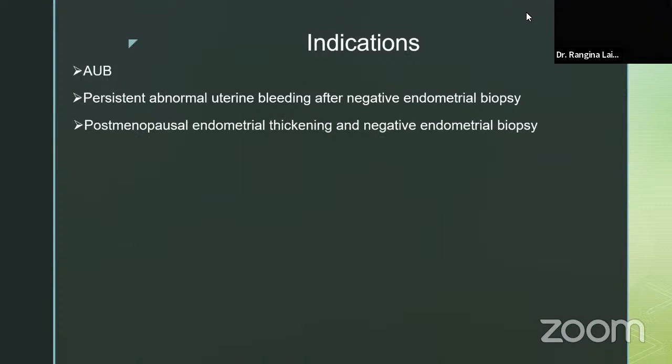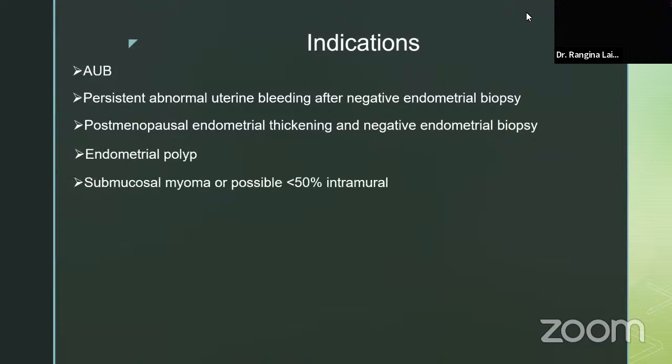In postmenopausal endometrial thickening, I have just shared my view about it. Endometrial polyp, I have talked about it. Submucosal myoma, yes. There are lots of studies which say that myomas around 3 centimeters we can remove hysteroscopically. But in my clinical practice, even my registrar has joined us today, Dr. Ritu Subedi, we have done even submucosal fibroids up to 5 centimeters hysteroscopically, although we did the case in 2 sittings. And uterine septum, it's very important.